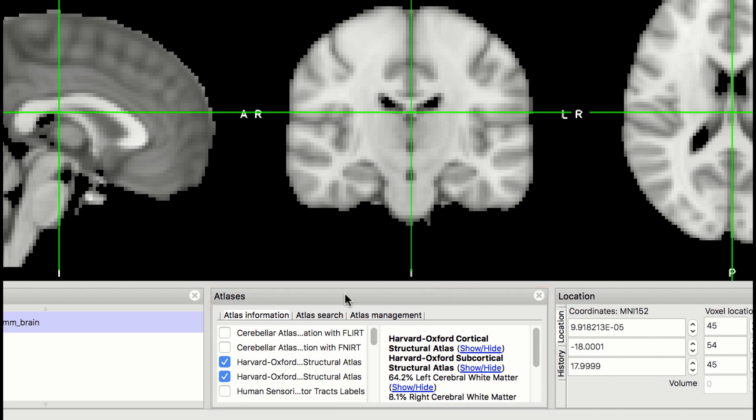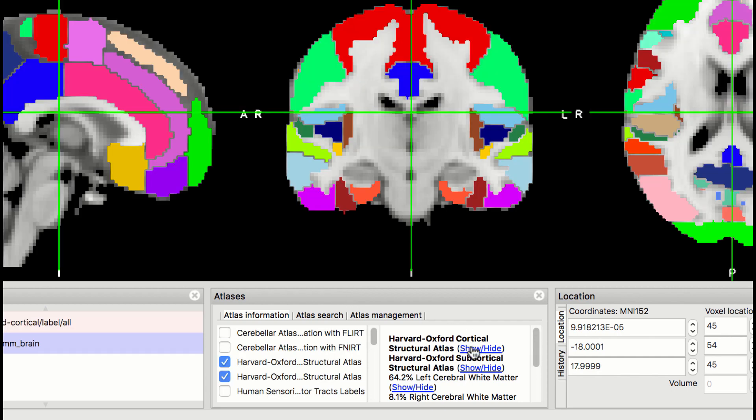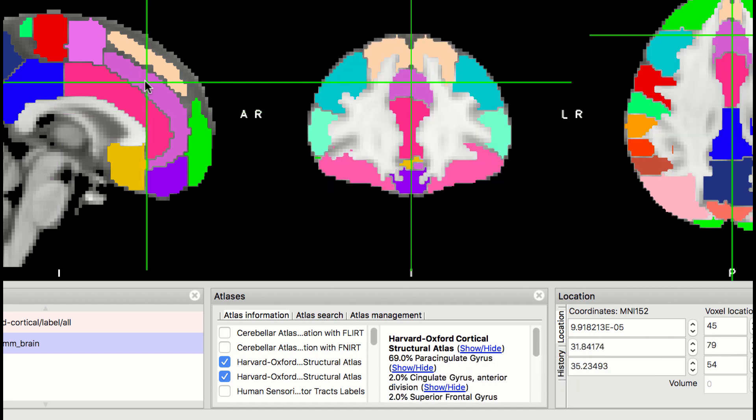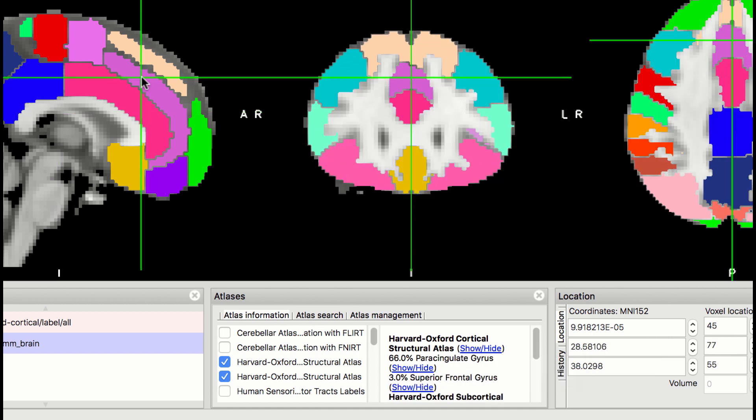By default, the Harvard-Oxford cortical and subcortical atlases will be loaded. You can see how the atlas partitions the brain by clicking on the Show-Hide link next to the atlas name. The Harvard-Oxford atlas is a probabilistic atlas, which means that the voxel at the center of the crosshairs in the viewing window is assigned a probability of belonging to a brain structure.